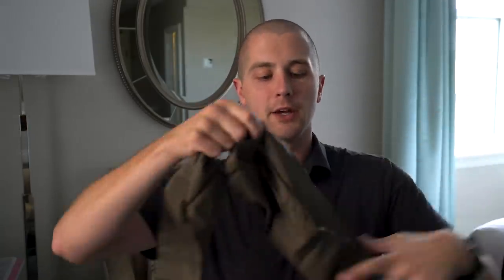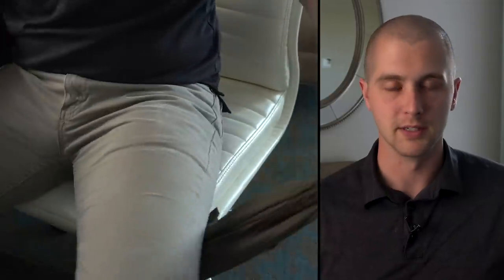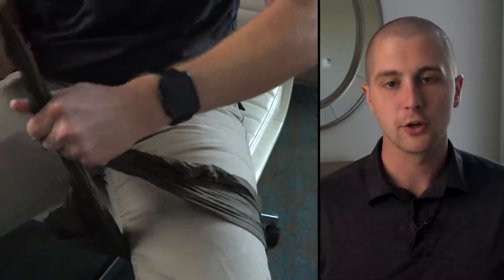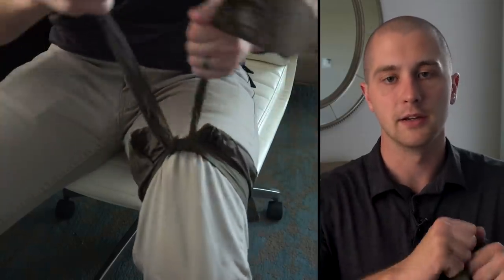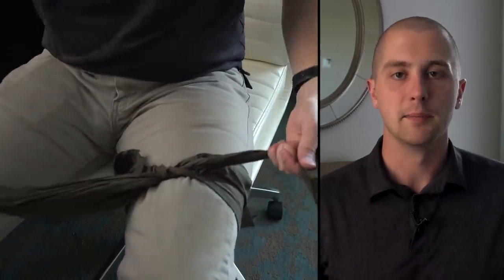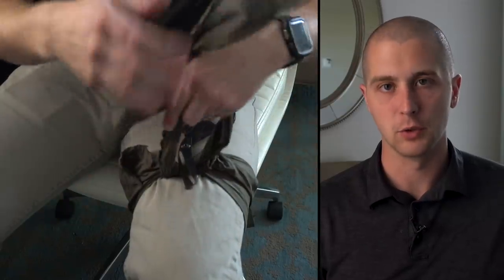To make a makeshift tourniquet, the first thing you're gonna do is take your main, most sturdy piece of cloth and make sure it's pretty wide — you want this cloth as wide as you can get it — and put it over the arm or leg that's bleeding, above the injury site. They say two to three inches above the injury site, just not over a joint. You're gonna wrap it around the leg and tie just an over-under knot right across the leg. Then you're gonna put your makeshift windlass inside that and tie another knot on top, and potentially a second one depending on how well that fabric is holding.